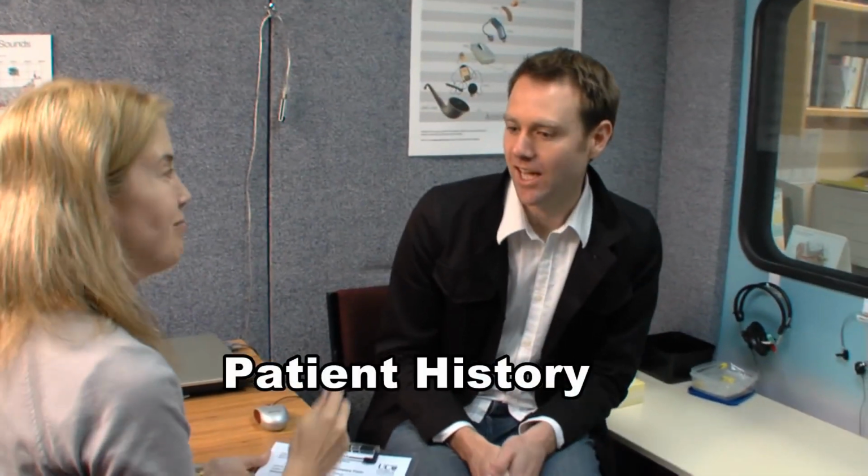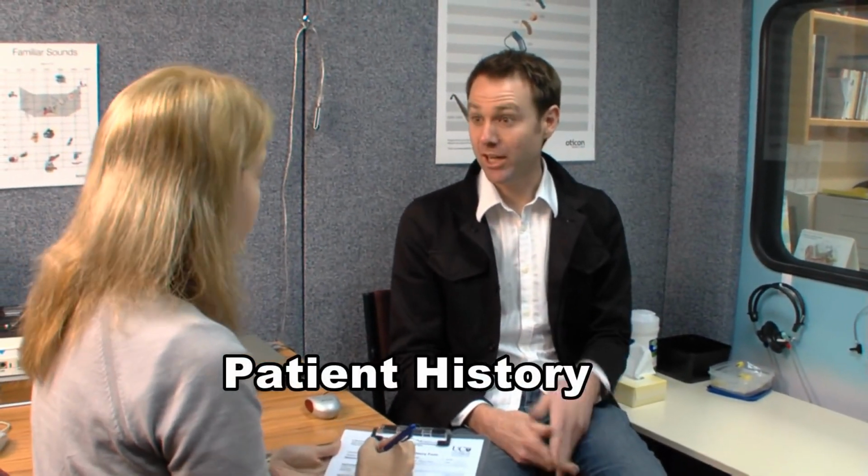So, what brings you in today? Well, I'm having a bit of trouble hearing in background noise. I listen to a lot of live music. After greeting the client, the audiologist's first step is taking a detailed case history. Okay, and how long's that been going on for? Probably about 6 months to a year.